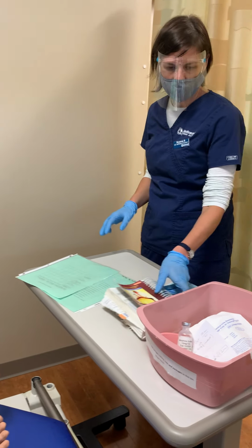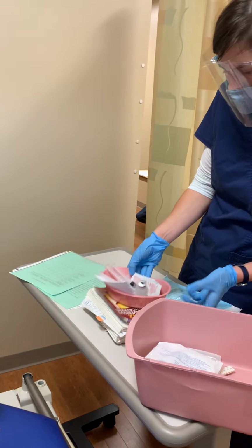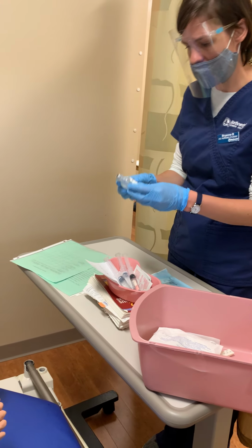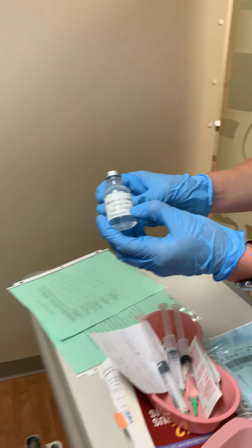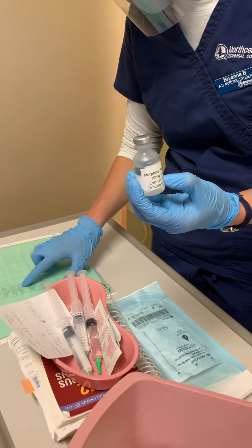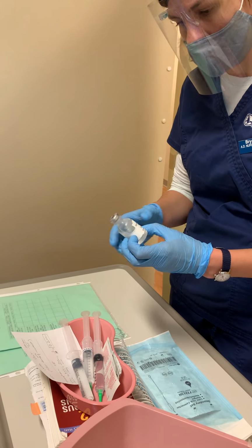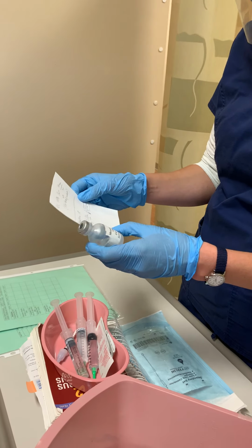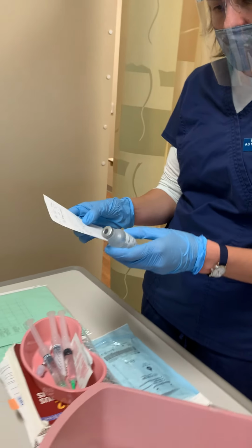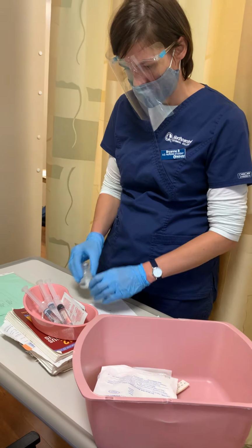So I want to administer my morphine IV push, and I've done my math. I have morphine 10 milligram in 1 ml. My doctor ordered 2 milligram IV push every hour as needed. So after doing my math, I've calculated out that I'm going to give 0.2 ml to equal out to that 2 milligram. Okay.